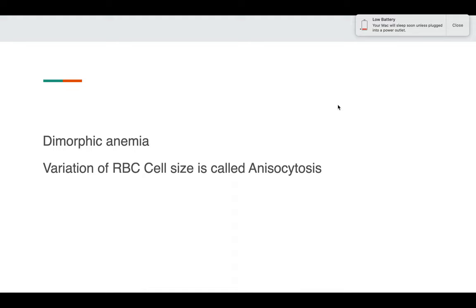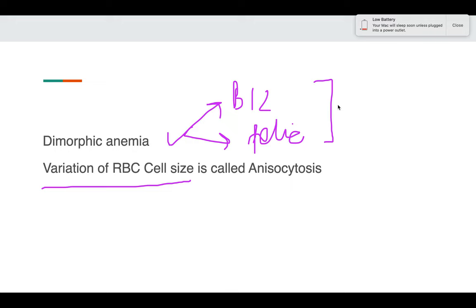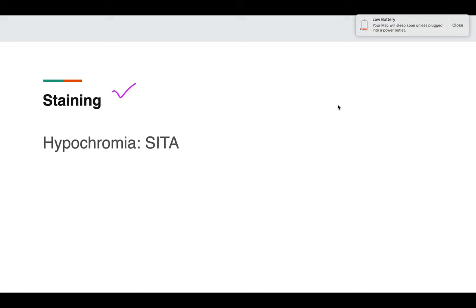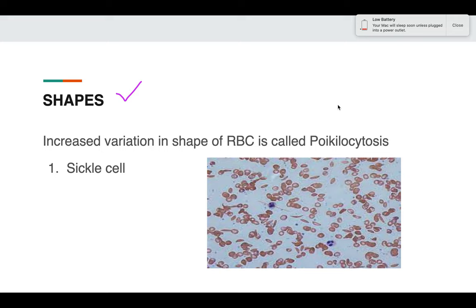If the patient has nutritional anemia and is deficient in both B12 and folic acid, both populations of RBCs can be seen — this is known as dimorphic anemia. A dual population variation in RBC cell size is known as anisocytosis. Regarding staining: one third should be the paler area. If it is more than one third, this is known as hypochromia, which is seen in the same causes as microcytes — sideroblastic anemia, iron deficiency anemia, thalassemia, and anemia of chronic disorders.